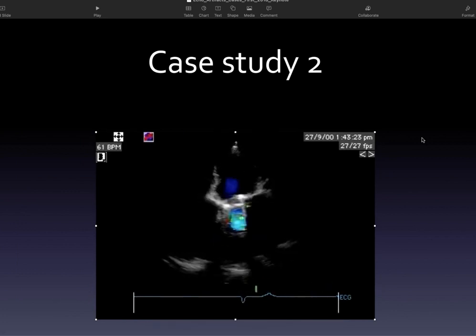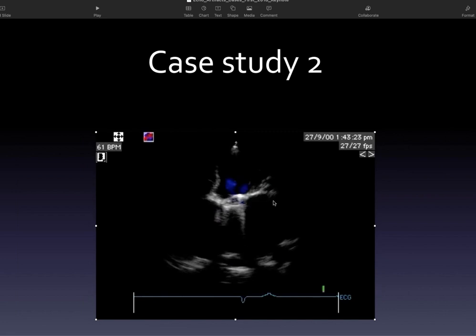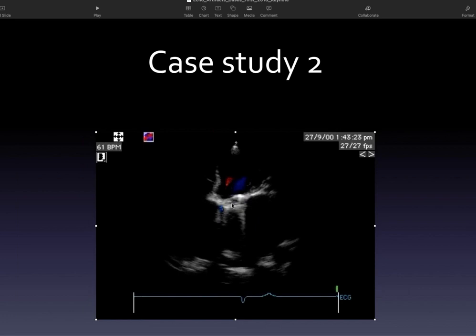Are you able to see the loop, that there's a color flow in the left atrium, which is right over here? So the point is, there's a huge left atrium, there's a mechanical mitral valve in between, and then there's a left ventricle over here. And then you get this color jet that is blue, that is only occupying the superior portion of the left atrium and doesn't go very far anywhere. Can you see that blue jet here?